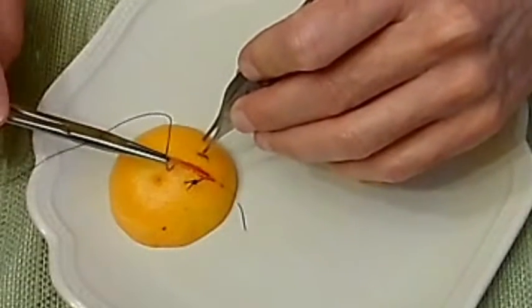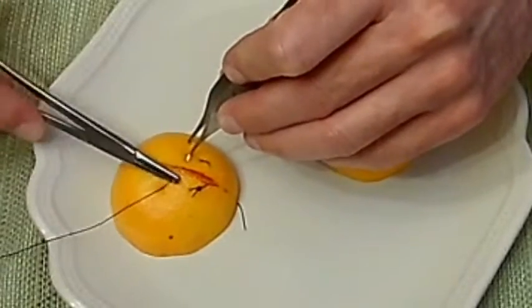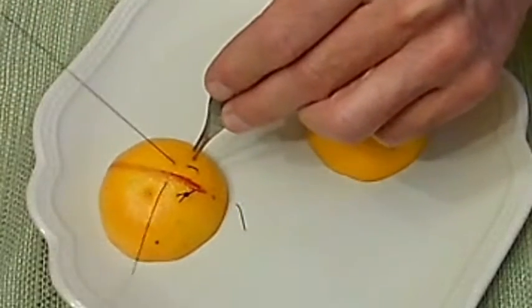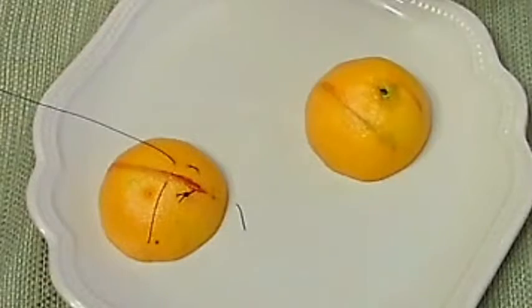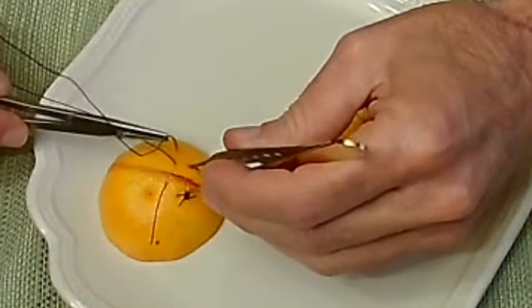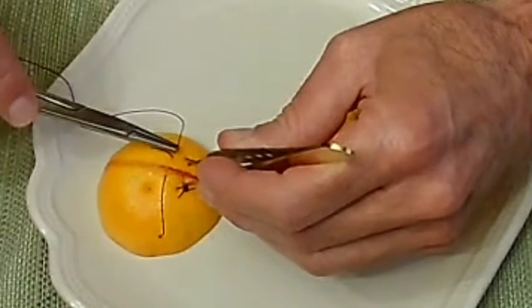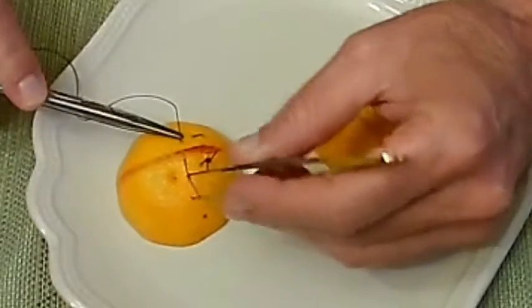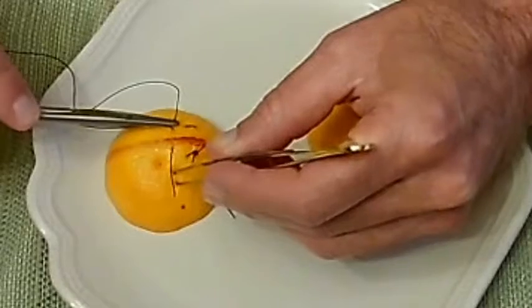It's good for approximating thick skin, and it tends to evert the edges. This now is going to be a vertical mattress, and the point is that there's going to be a near and then a far. The near one is to accurately align the skin edges because it's so close to the edges. You could actually pick up the inner suture — the little two limbs — or have your assistant do it, and it would tent the skin up and allow you to do this far suture in one pass.